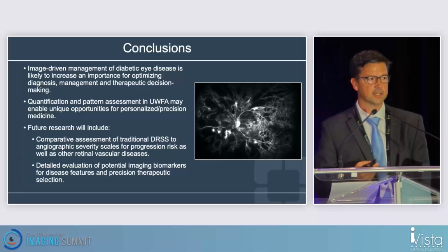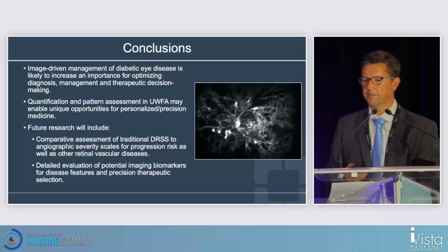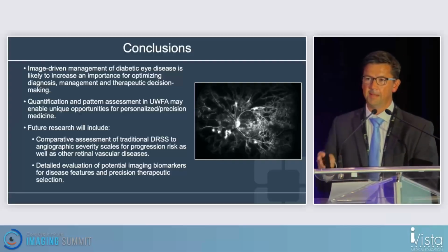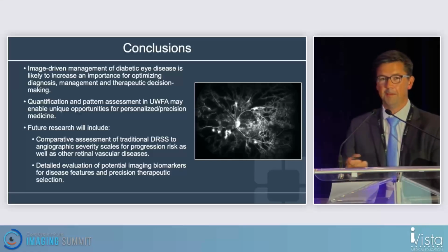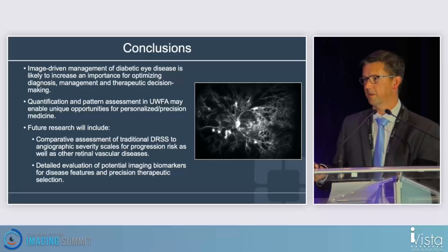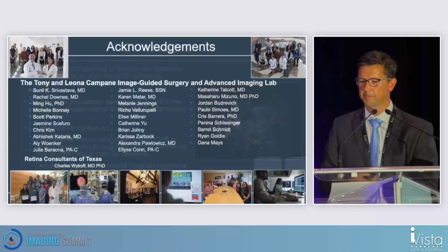take care of patients. For diabetic macular edema, obviously OCT is the anchor of what we use for that, but ultra-wide field angiography may really help inform how we look at diabetic retinopathy as well. And being able to compare this, if we can look at things like an angiographic severity scale, may be really important for us to put away some of our traditional diabetic retinopathy severity scale based on fundus photos alone, to better classify more on a continuous scale the way that we look at our patients.